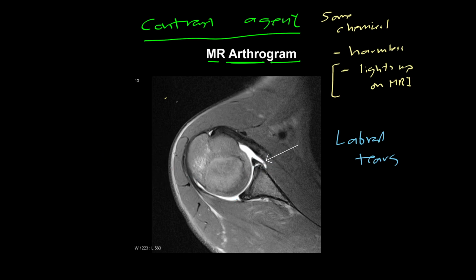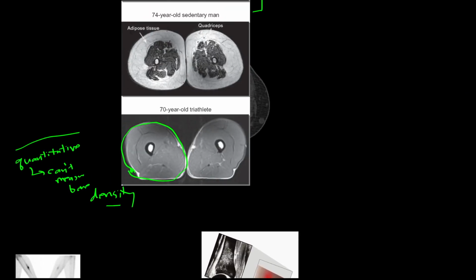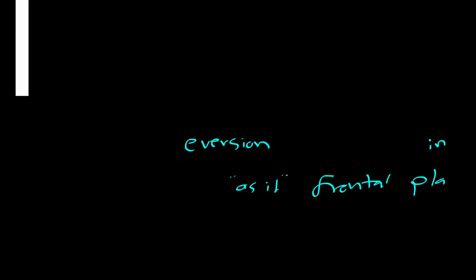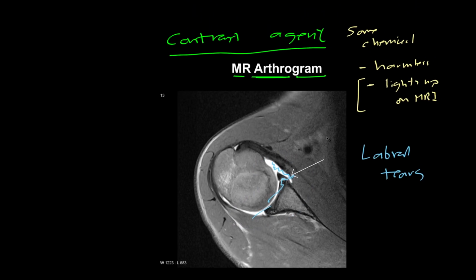It's really common for hip injuries because on a regular image, this area tends to be dark. Like it's very, very dark. Do I have an example of that? Maybe. I think I have a knee MRI here, if I get this thigh out of the way. Maybe not. Well, generally, without a contrast agent, this area is dark, meaning you can't really see it. So contrast agents are nice for that purpose.